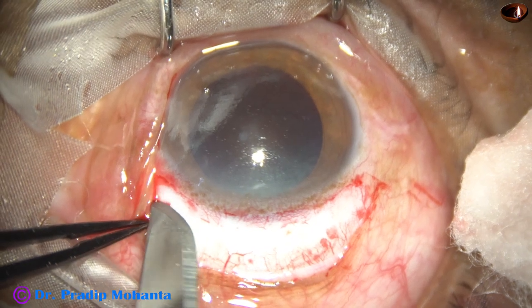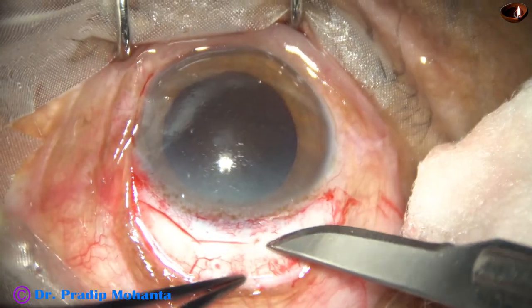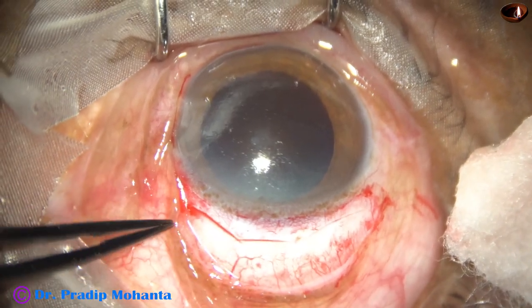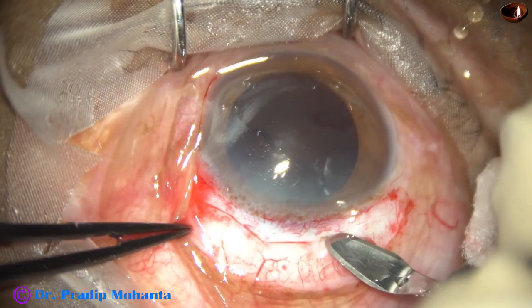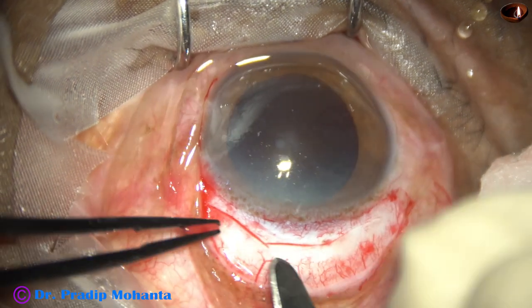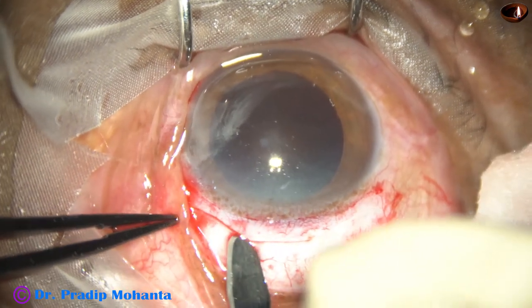And here it is. This is about 3 to 3.5 millimeter. This is about 2 millimeter. This is about 3.5 millimeter. So this is about 9 millimeter incision, and I am going to make a sclerocorneal tunnel as we do in small incision cataract surgery.